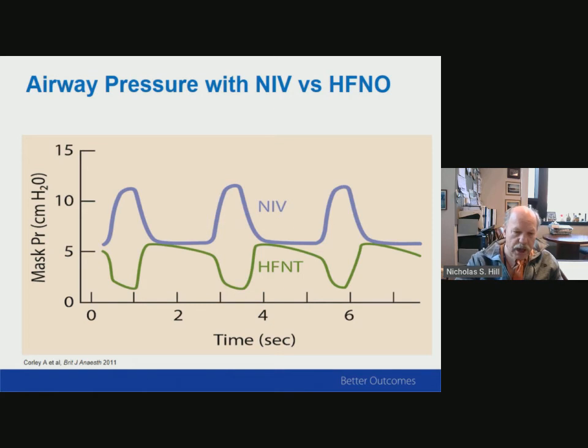But this means that non-invasive ventilation in patients who are quite hypoxemic will most often be a better way of oxygenating, because you get a higher mean airway pressure that is sustained, because that's the target you set, and a better mean airway pressure generally means improved oxygenation.